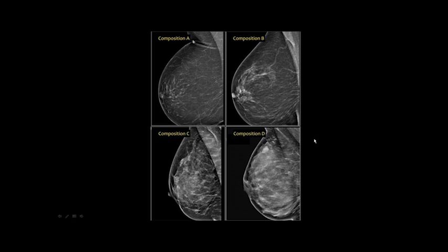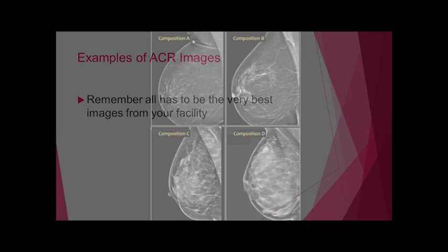And I know there's new software out there that you could purchase from different manufacturers that gives it a more exact density reading. There's now like 4 or 5 of them on the market. So I know that helps with the density reading, with the density laws that have changed in, I think it's 27 states that have the density breast laws.